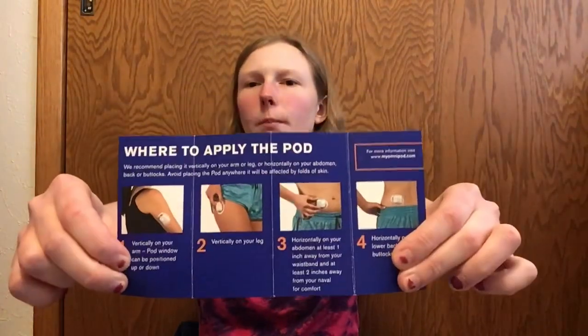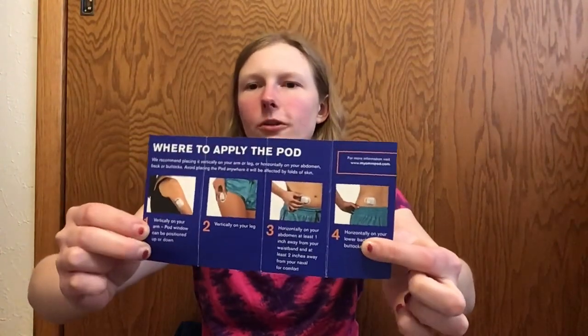I'm going to apply this pod now. I'll probably put a sticker on it and show a picture of what I decorate it with after placing it on my arm. You can place it on your arm, leg, or stomach. They recommend horizontal placement on the stomach or back, and vertical on the thigh or arm — though either direction works. You can do it with the cannula facing down or up. I'm going to try cannula facing down, since that's how I see a lot of people do it.